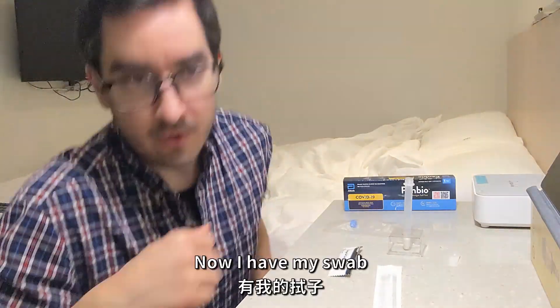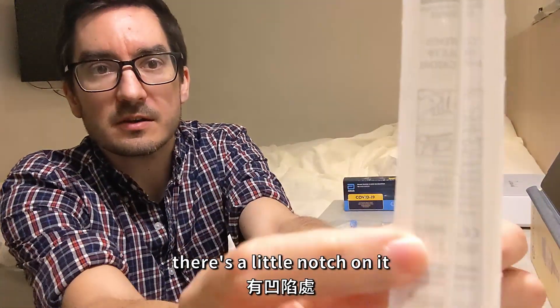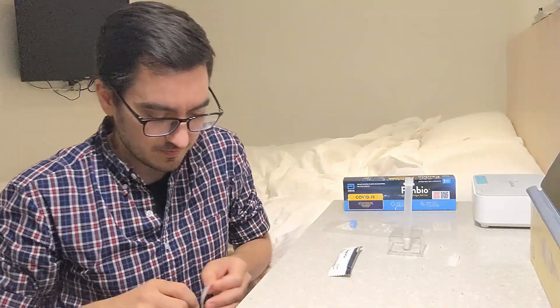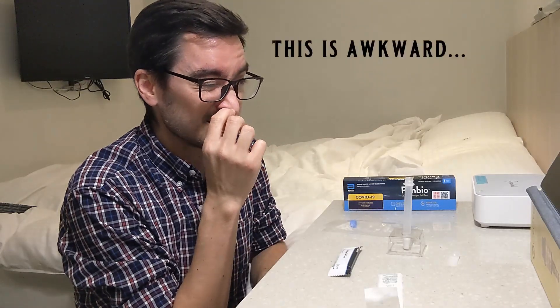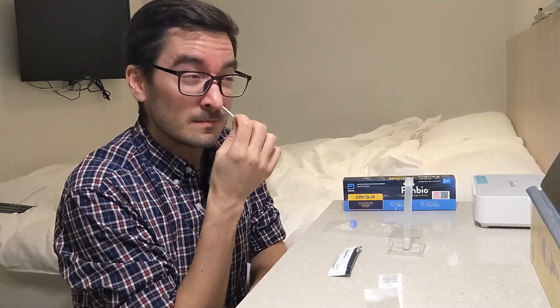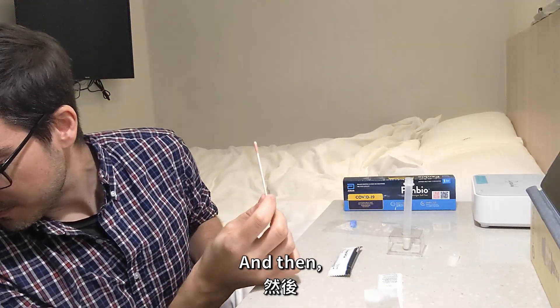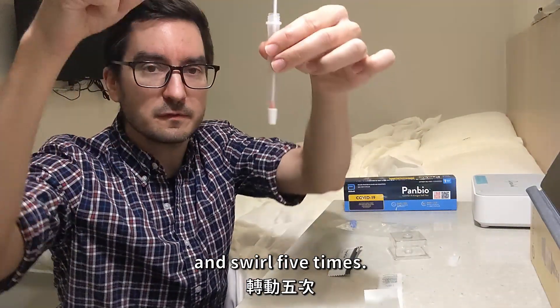Now I have my swab — the fun part. This swab, if you can see, there's a little notch on it where you can break the swab later. What you do is stick it up your nose — stick it up both nostrils. I've done this a bunch. Put it into the liquid and swirl at least five times.